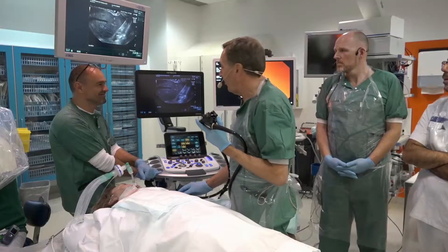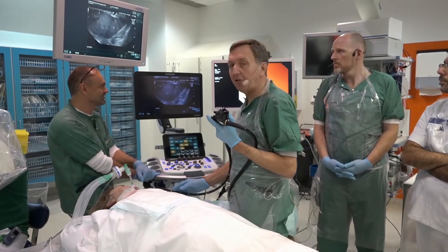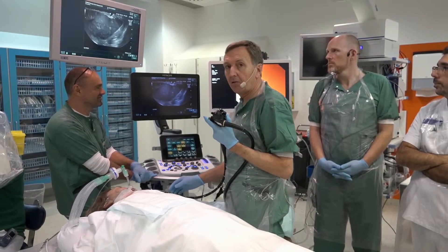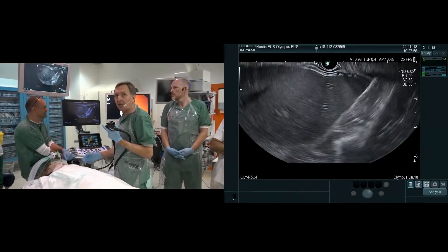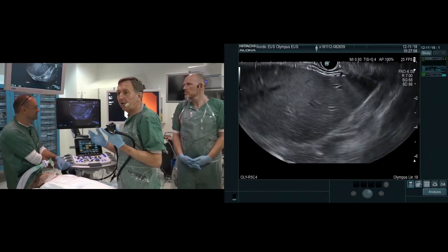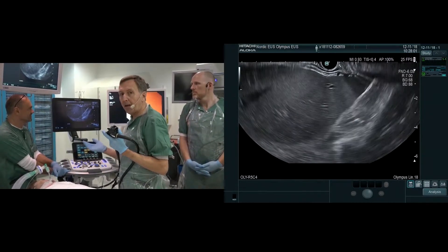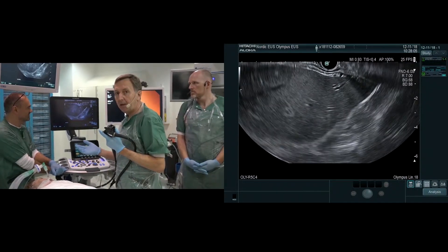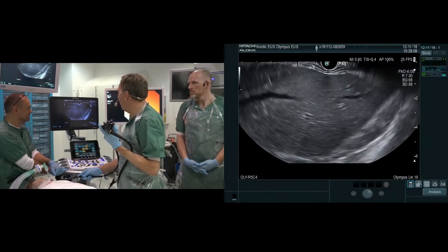You have perhaps already the ultrasound image. You heard the history of the patient. In these cases, it's always important to look whether the patient has any cholestasis. You can do it in two ways: you can begin in the intrahepatic ducts, or you can directly go down to the common bile duct. I looked first to the liver.